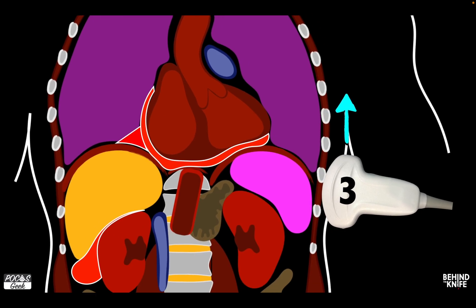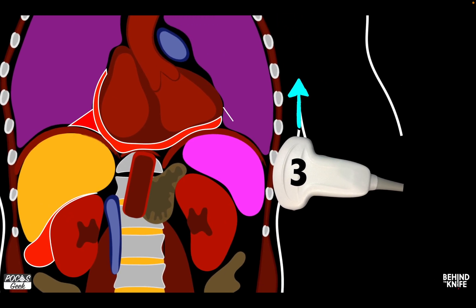After evaluating the sub-xiphoid space, we're going to move the probe over to the posterior axillary line in the left upper quadrant. Because the spleen is smaller, we need to move the probe more superior and more posterior. In the left upper quadrant, we're going to see fluid at the poles of the spleen first, and then it's going to track above or superior to the spleen. We seldom see fluid collect between the spleen and the kidney, and this is due to the splenocolic ligament, which does not allow fluid to typically go down into the paracolic gutter.